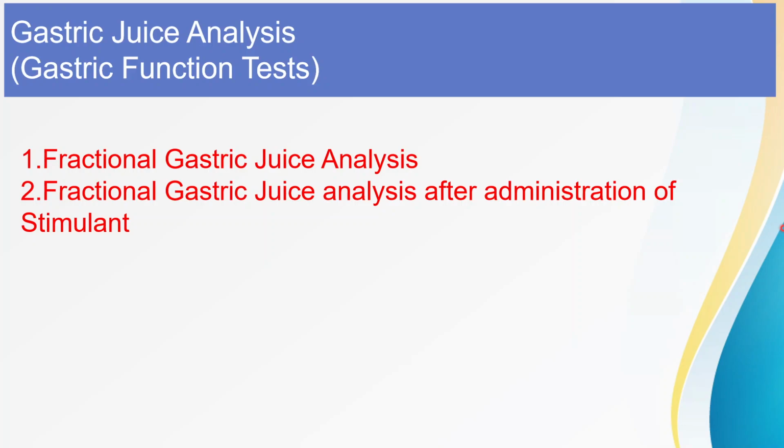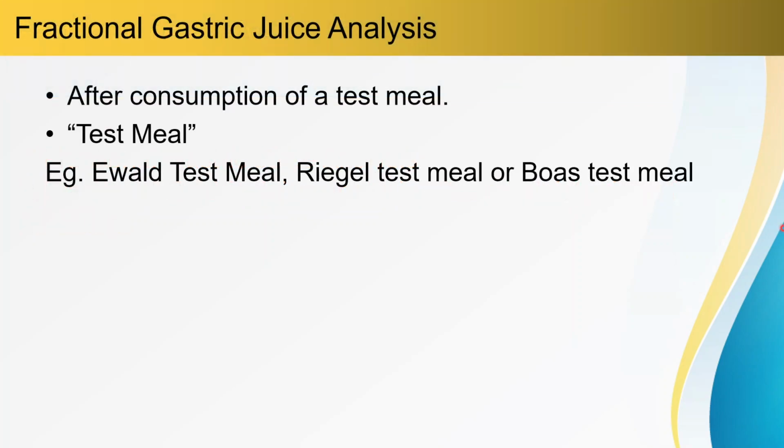After giving a stimulant or a test meal, we do the analysis of gastric juice. So this is about the fractional gastric juice analysis.